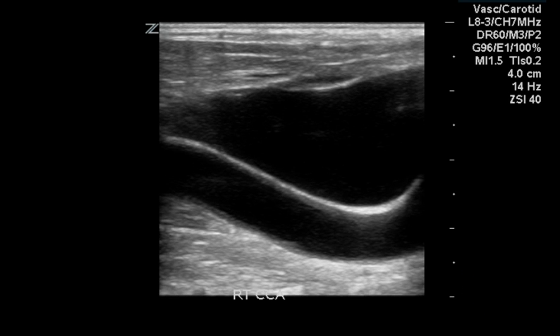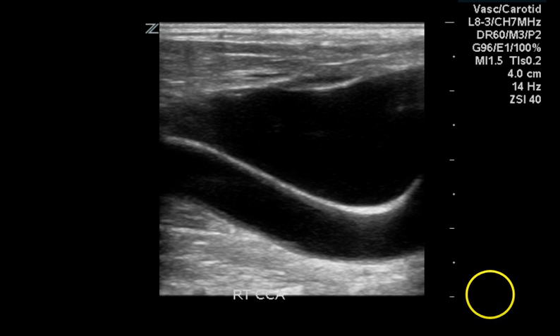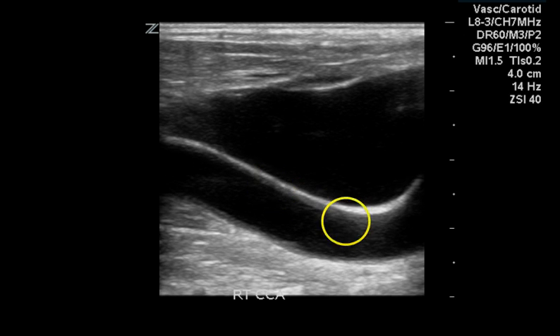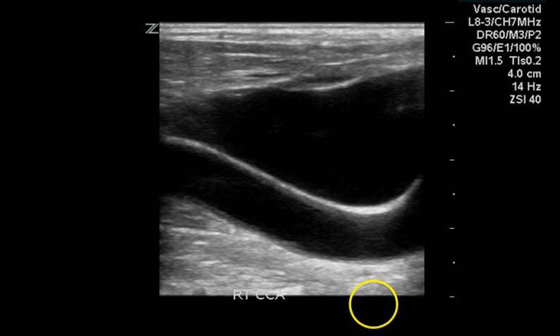This is a longitudinal image of the common carotid artery. A small amount of intimal thickening may be present, but no substantial plaque can be identified on this image.